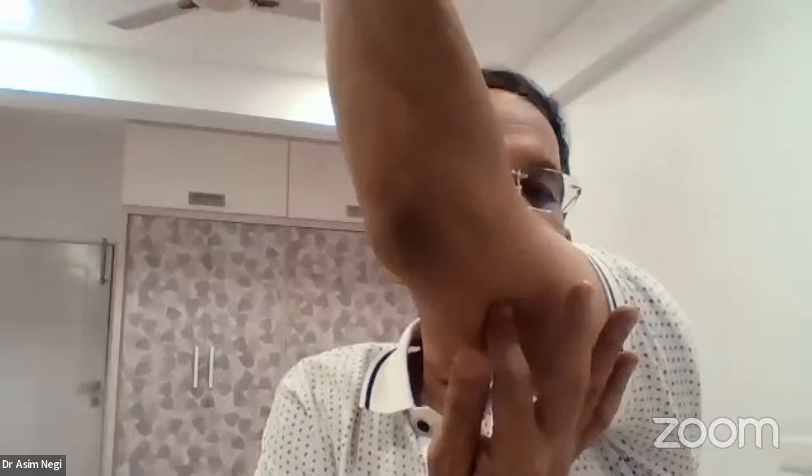So you pass wires from posterior to anterior. It starts here in the humerus metaphysis about 3 cm above, slightly near the posterior cortex. Proximal to distal, lateral to medial. And proximal to distal, posterior to anterior.